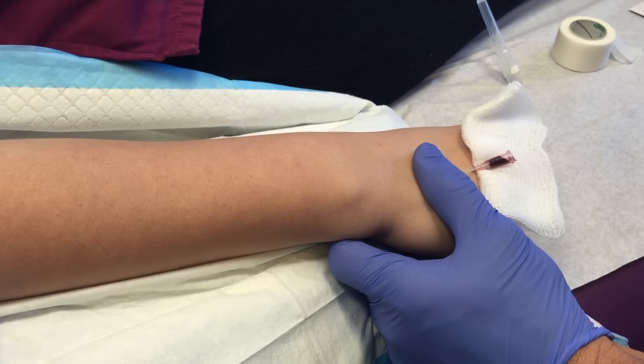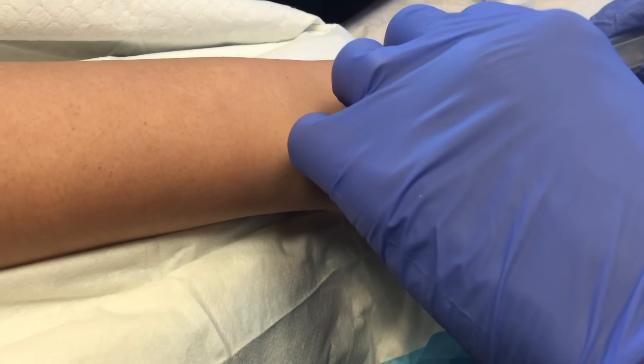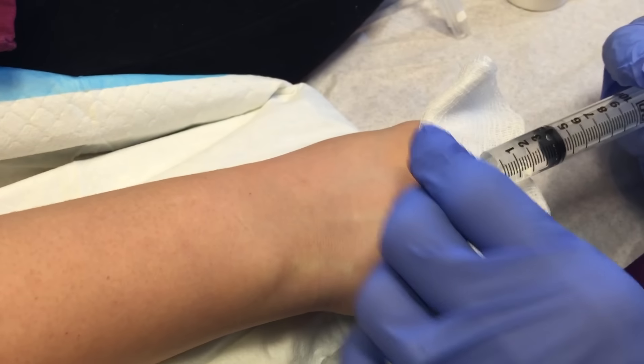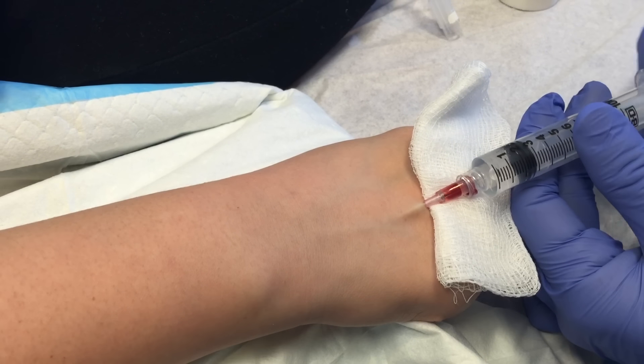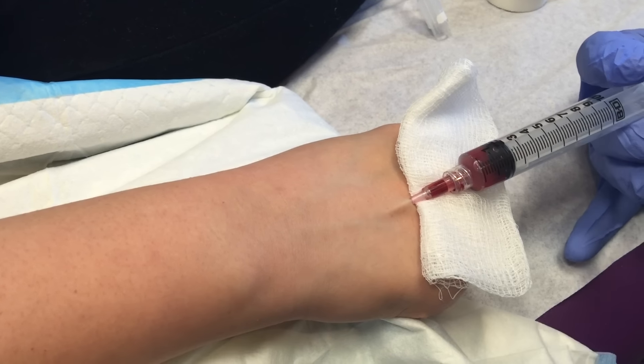I'm going to release the tourniquet. Right now I'm injecting a little bit of saline just to show that it's flowing nicely — see? Put it in. See it comes back out. So we're really good.